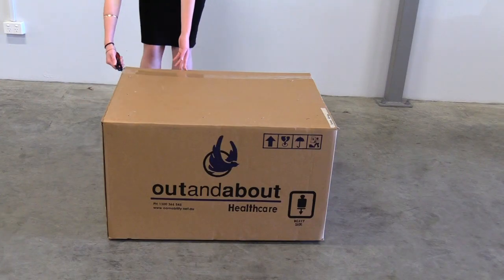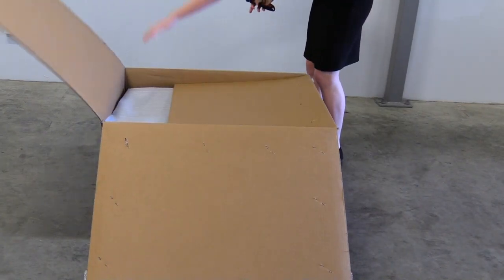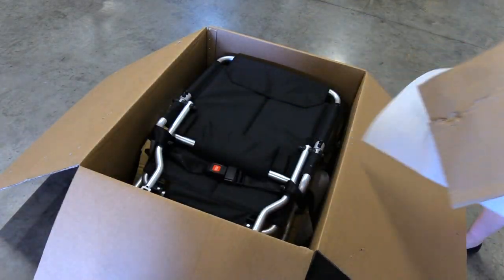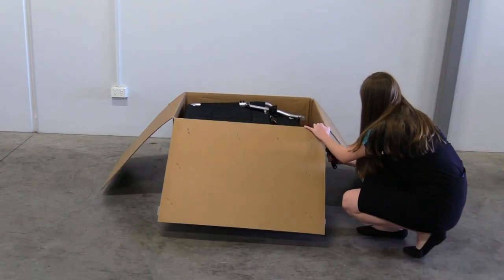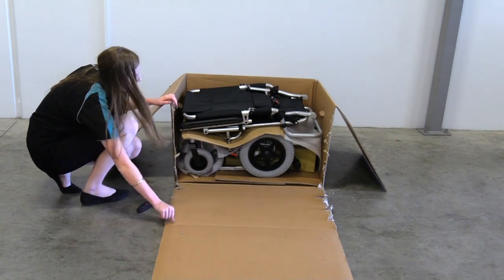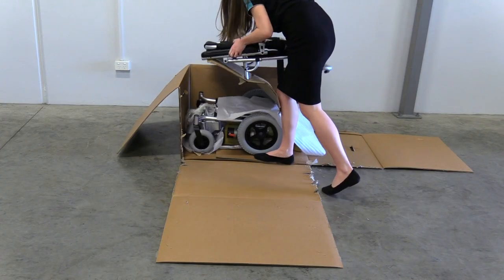Now that you have your brand new Puzzle, it's time to open it. We recommend cutting the box down the sides to make getting your Puzzle out easier. Once the sides are cut, remove each part from the box.